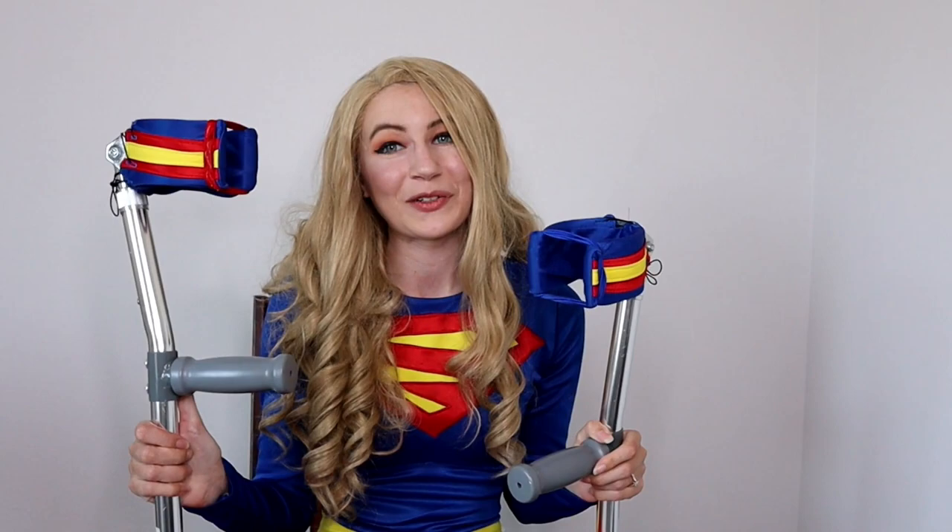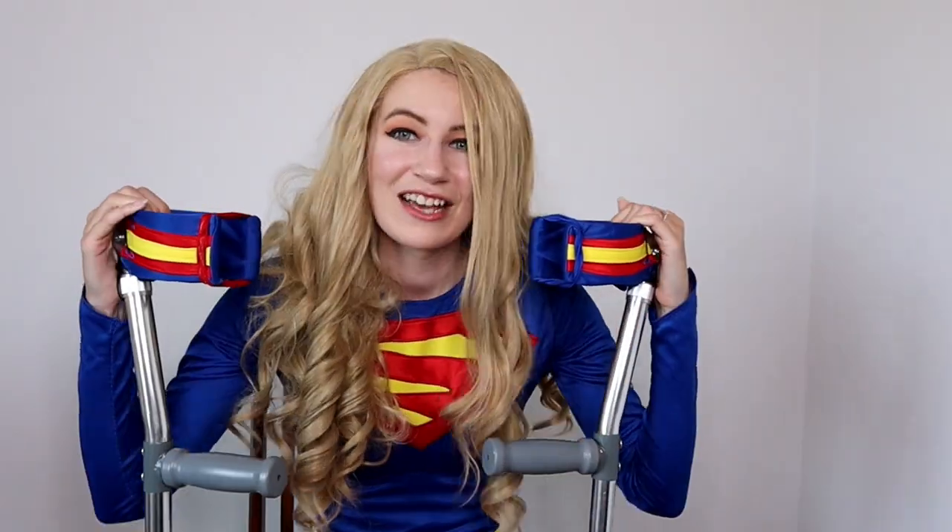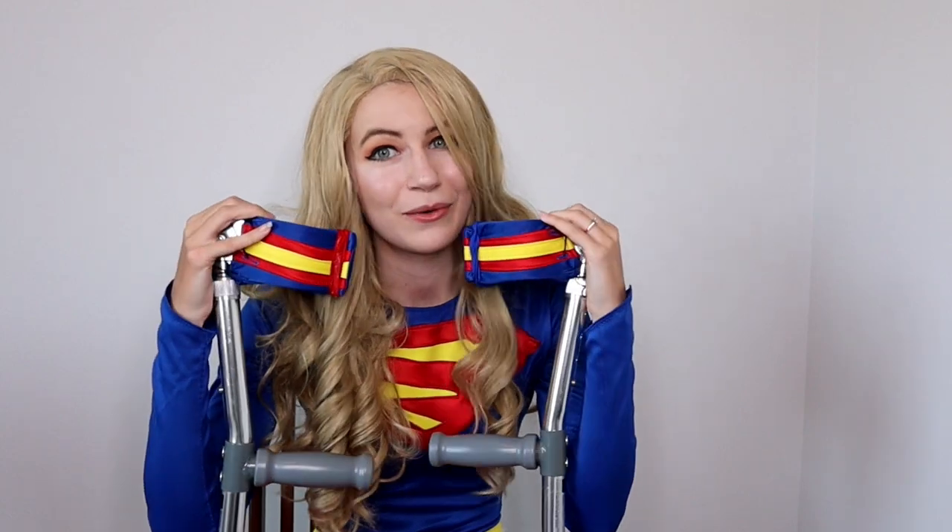Hello everyone and welcome back to Calling Cosplay. Today's tutorial is going to be a little different since the cosplay I am making will not be for me. So let's welcome our very special guest stars today — my forearm crutches! This is Reginald the right and Louise the left. I felt that it was long past time to make them their own cosplays, so I made little Supergirl cosplays for my forearm crutches.